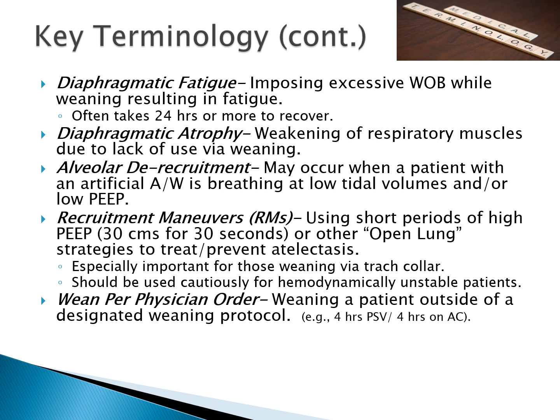More definitions here. Diaphragmatic fatigue. If we work a patient too hard, if we put them on 6 or 8 of pressure support, and their RSBI is approaching 100, 105, so they're chugging away with a respiratory rate well in the 30s, a tidal volume that's maybe 250, ending up with an RSBI in that low 100s type of range, what we can do to them is actually set them back. We can give them diaphragmatic fatigue.